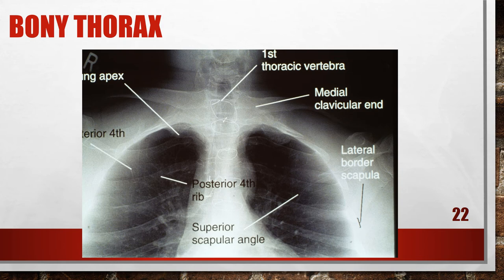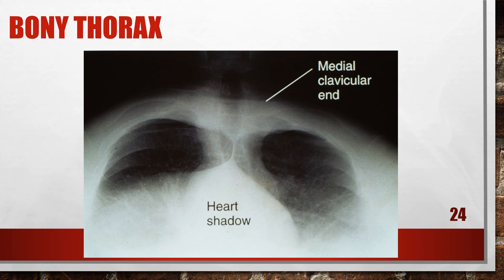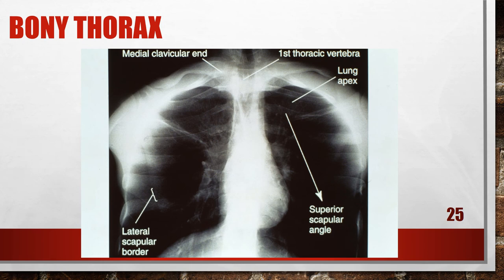Here is an accurately positioned lordotic chest, which we don't shoot that often, but this is how it should look. This is a lordotic chest with insufficient central ray angle — they did not angle high enough, and the clavicles need to be well above the apices. This is a lordotic chest with excessive central ray angulation — they have angled too far toward the head. And this is a lordotic chest with inadequate anterior arm rotation — the central ray angle is okay, but the patient's arms are not positioned appropriately.